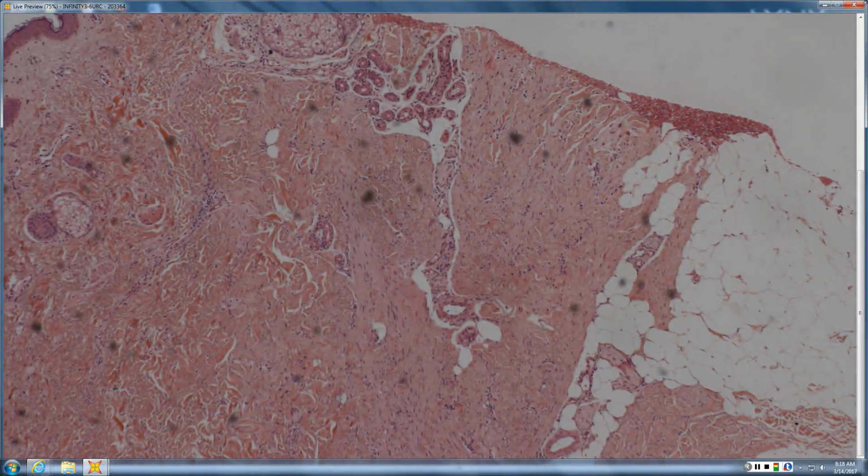What would this very polite proliferation be called? A dermatomyofibroma. So dermatomyofibroma, they are corkscrew myofibroblasts, which is why it's a myofibroma, right? And they are east-west in orientation, but they respect the adnexal structures and don't replace them. A scar, you would expect your adnexal structures to be wiped out.